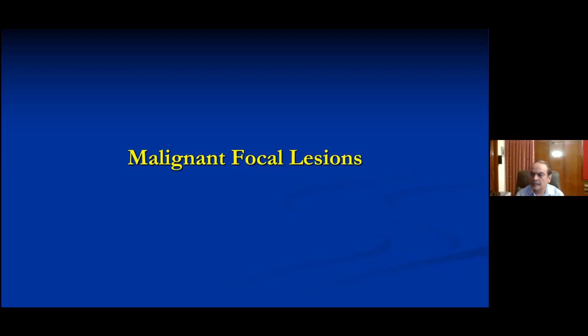So next one is from Pierre Ratna from Sri Lanka, and he's asked, what is the best imaging for a liver hemangioma? In the ideal world, definitely an MR, a contrast-enhanced MR, is the ideal tool which can diagnose with a lot of diagnostic confidence. But if you don't have access to MR or cost considerations are there, a multi-phase CT is the next best substitute.